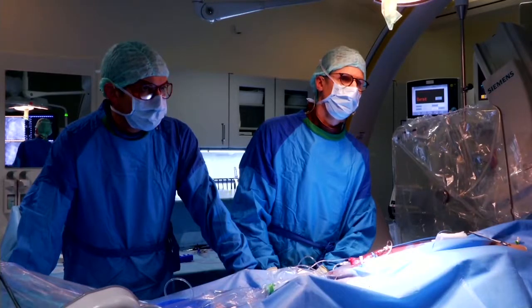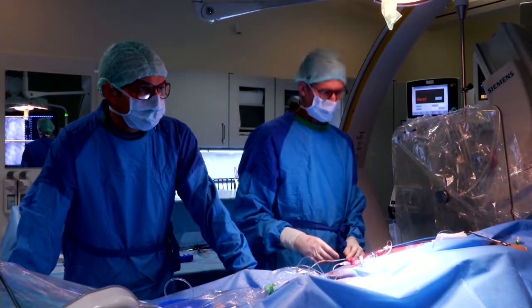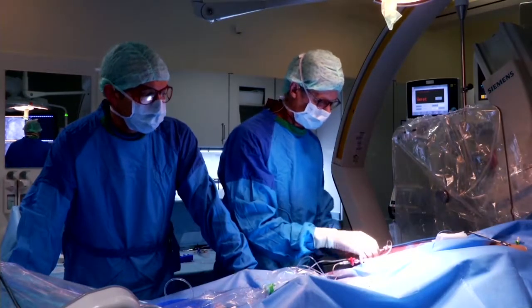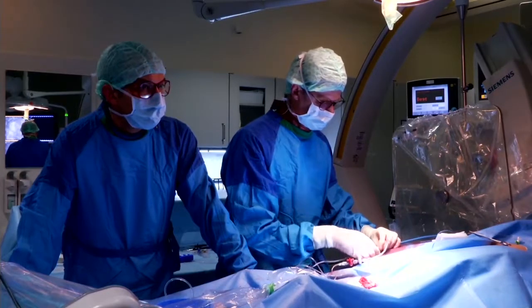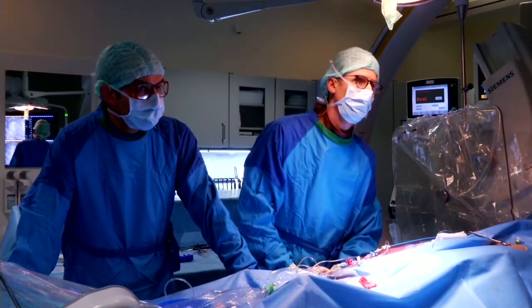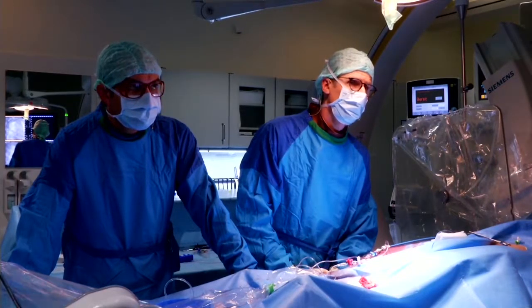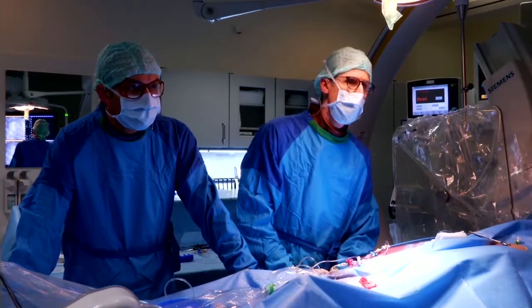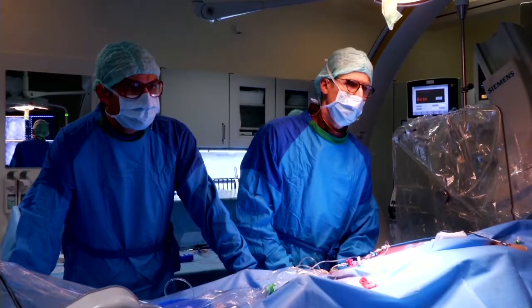Thank you. There's another comment. Are you able to take another comment? This is Edmundo from Brazil. Sure. I would like to suggest, if you wanted to localize the exact gradient, you can use the guide catheter, a Y connection, and pull back. You can measure exactly at the point of the wire. I have done it. It has happened to me a lot.